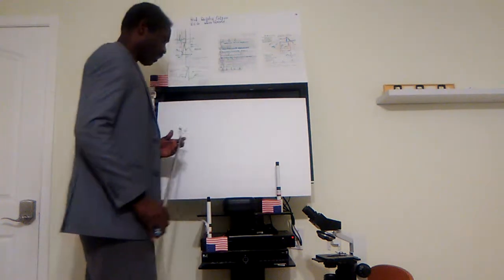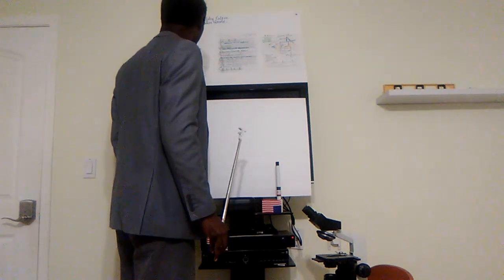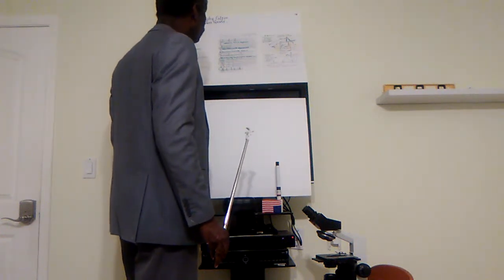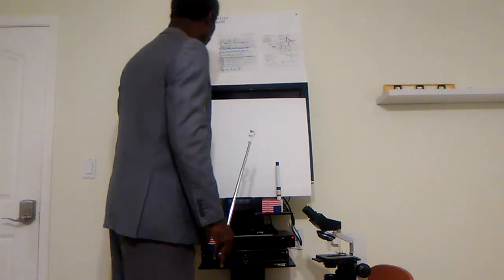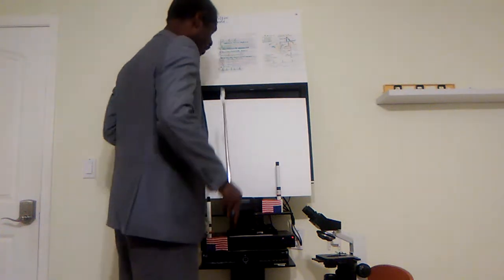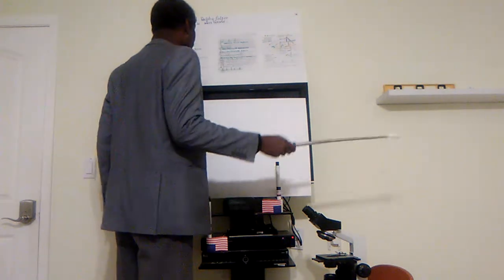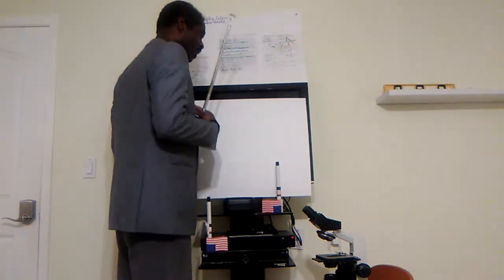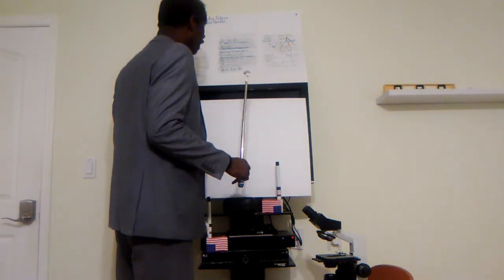So these are just some more notes on our ECG at this time, and we'll continue as time goes by to use our notes on the electrocardiogram to have a better understanding of this diagnostic instrumentation, used to measure the electrical activity of the heart. And note we could have what we call a resting ECG, in which the patient lies down and 12 leads are attached to various points on the body, the chest, hands, and going down.